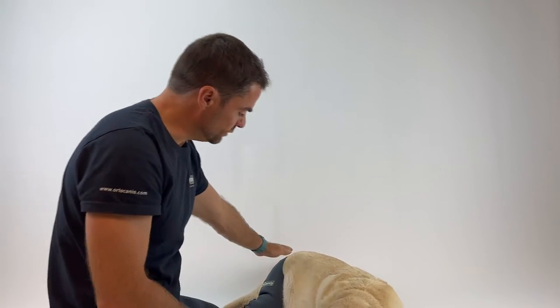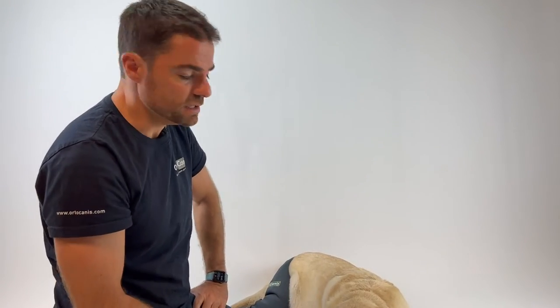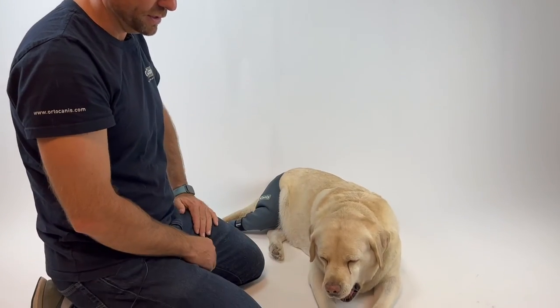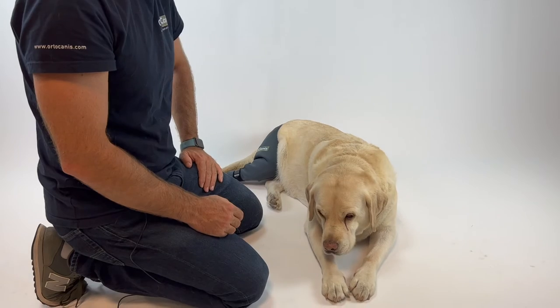The first day, it is best to start slowly using the knee brace — a couple of minutes, one hour maximum — then check all the area for redness or any reaction. Then start every day to prolong the use of the knee brace.